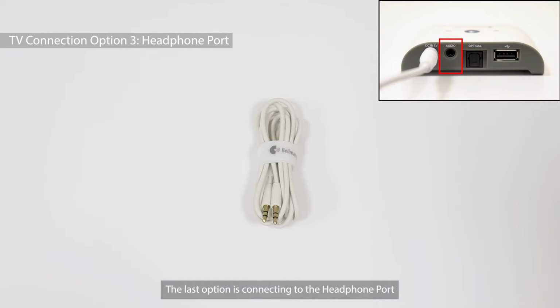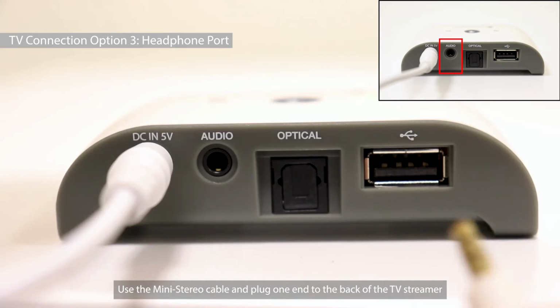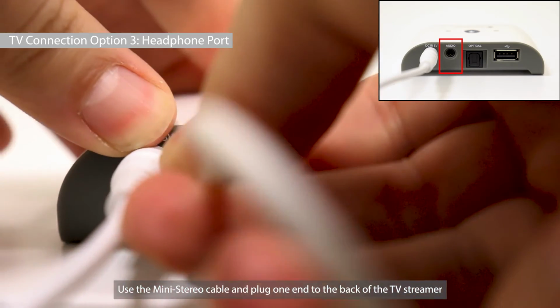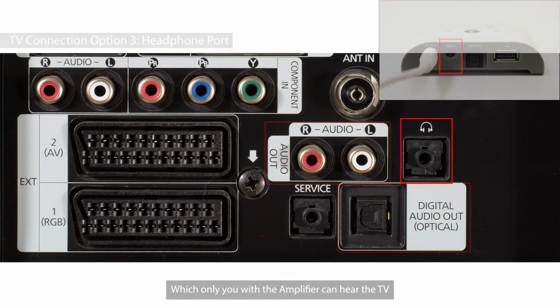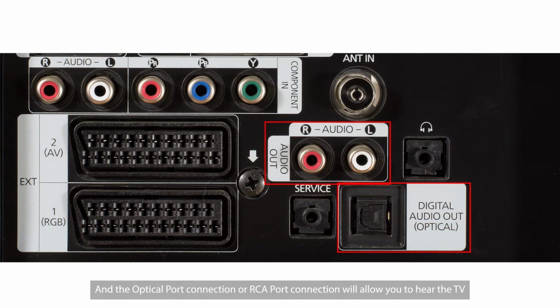The last option is connecting to the headphone port. Use the mini stereo cable and plug one end to the back of the streamer, and plug the other end into the headphone port on the television. Please note, the headphone port connection will block the sound from the speaker, so only you with the amplifier can hear the TV. An optical port connection or RCA port connection will allow you to hear the TV from the amplifier while others still hear from the TV speaker.